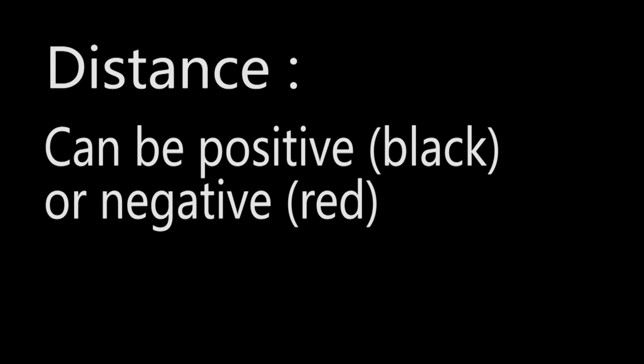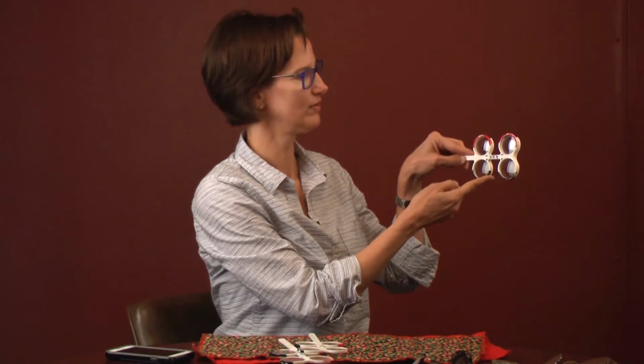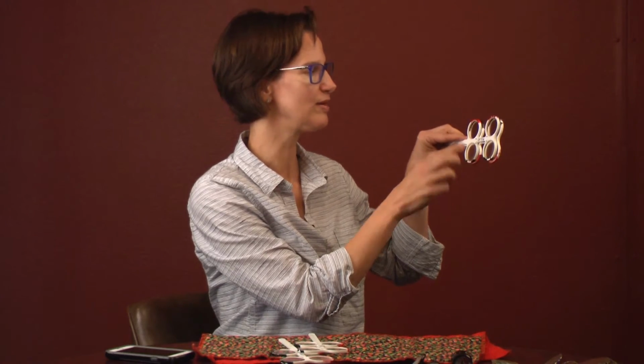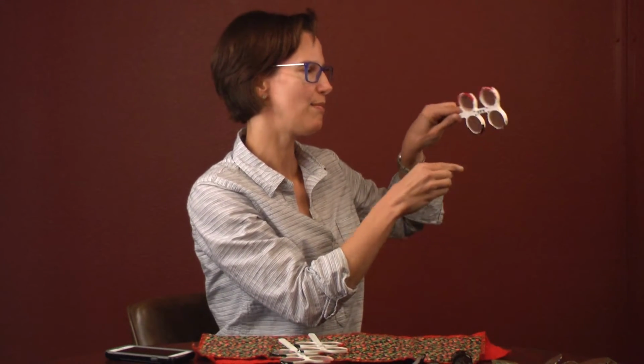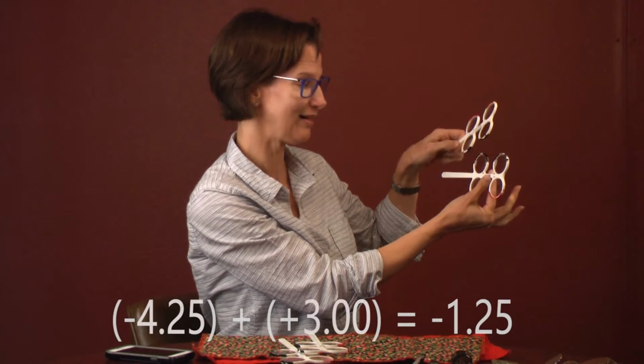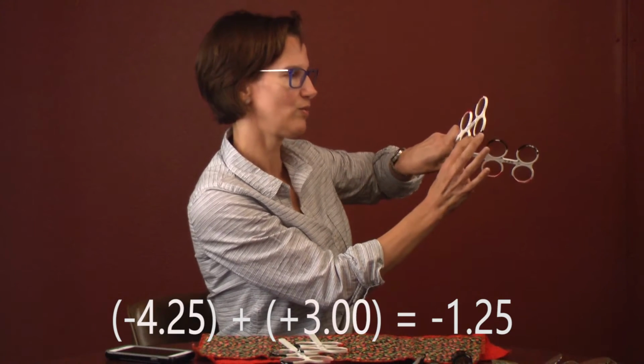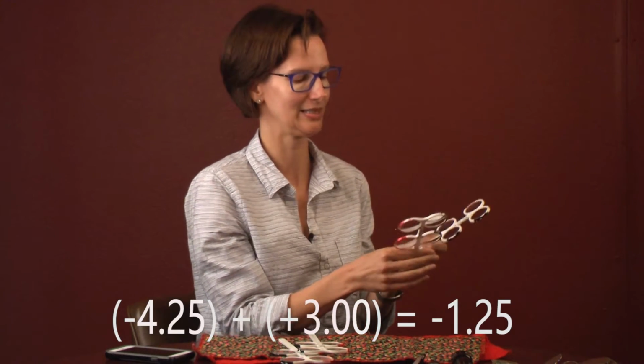I think the main thing to remember about the distance is your lenses for distance could be positive or they could be negative. So they could be farsighted or nearsighted and have trouble with their far away. So you need to try both sides when you're doing the distance because you have no idea which way it's going to go. And to get that 1.25, you add the negative 4.25 with the positive 3. Hope this is making sense.